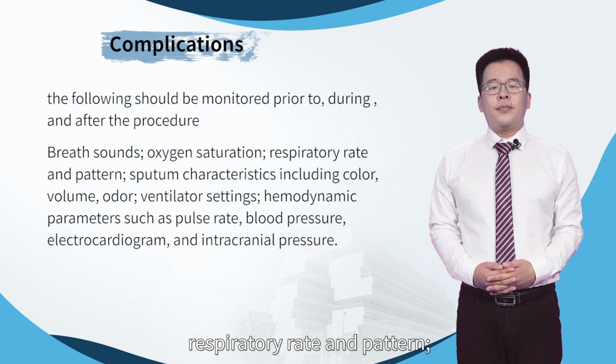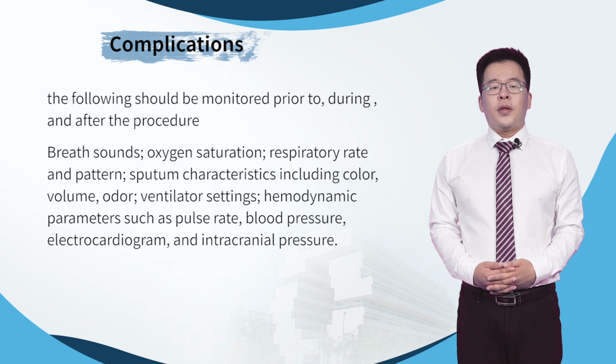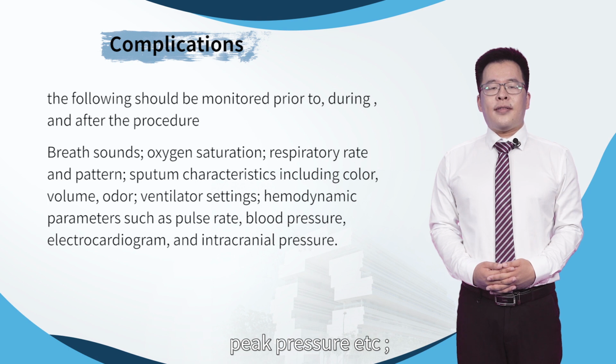So, the following should be monitored prior to, during, and after the procedure: breath sounds, oxygen saturation, respiratory rate and pattern, sputum characteristics, including color, volume, and odor, ventilator settings such as tidal volume, peak pressure, etc., hemodynamic parameters such as pulse rate, blood pressure, electrocardiogram, and intracranial pressure.